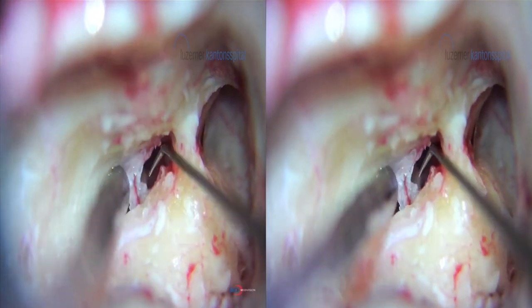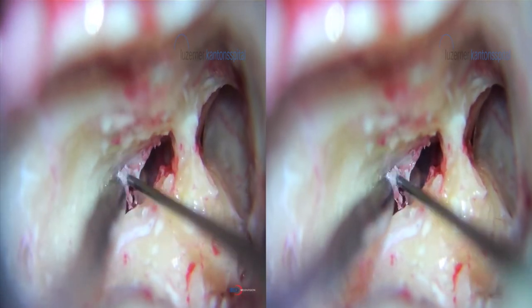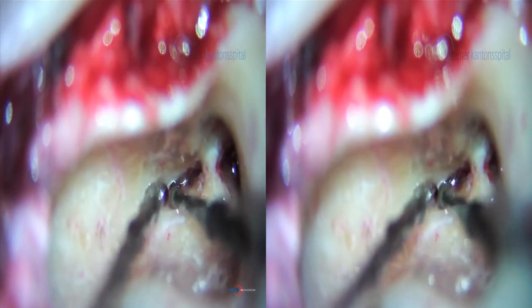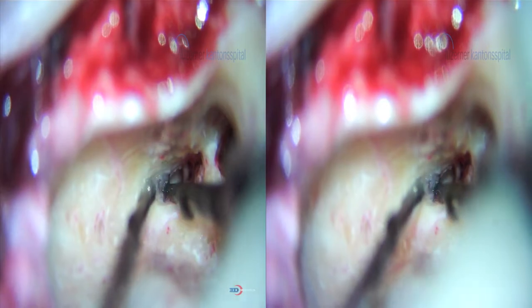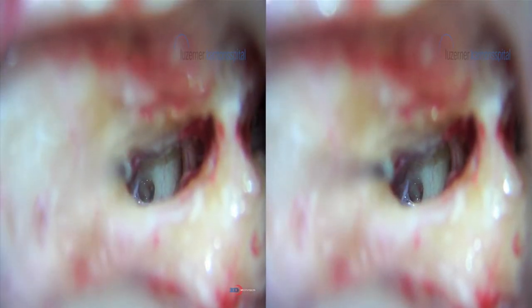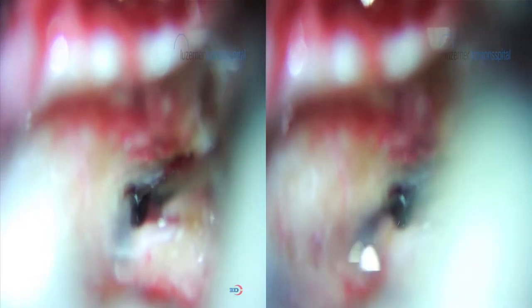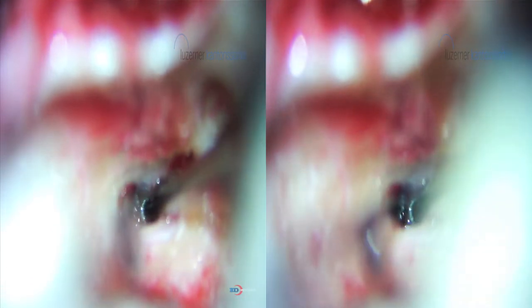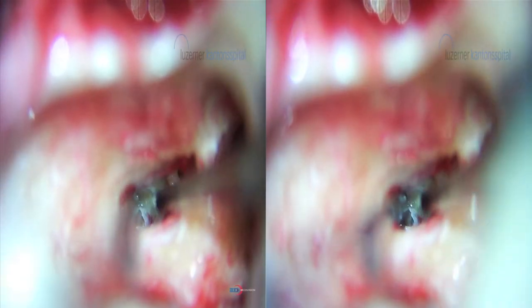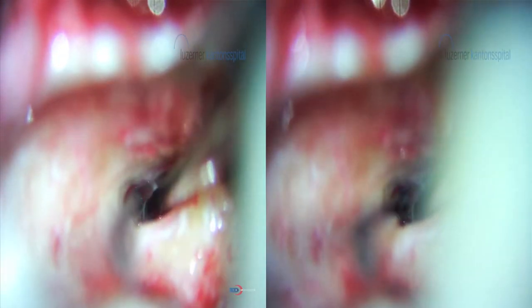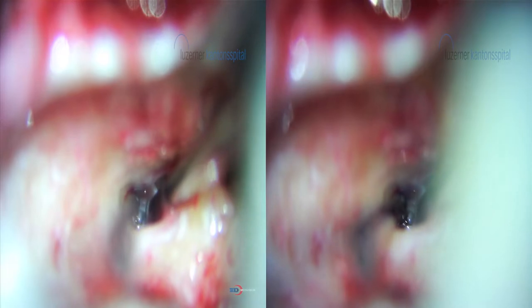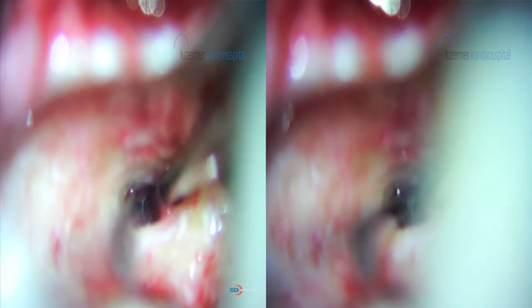Here again a sclerotic posterior tympanotomy and facial recess, opening widely to see first the stapes and then the round window, expanding it inferiorly and drilling away the lip of the round window for proper identification of the round window membrane.